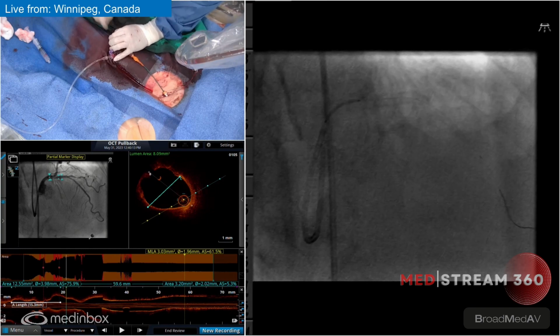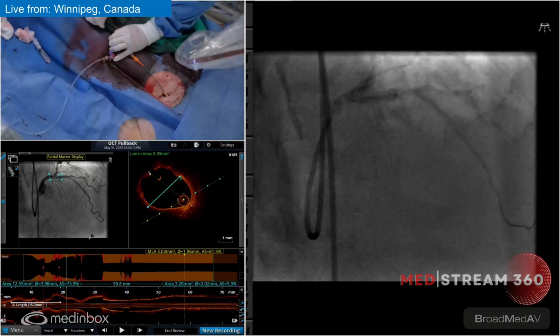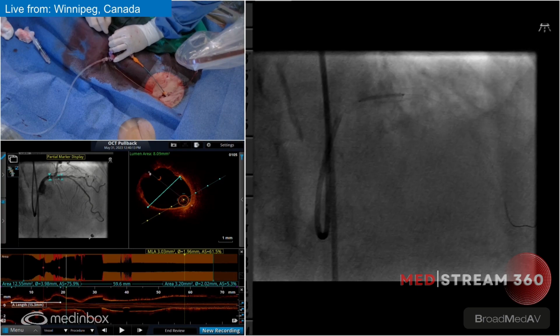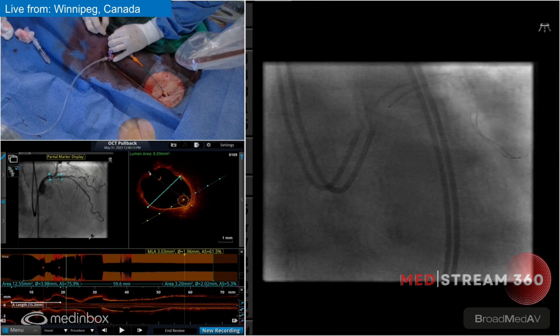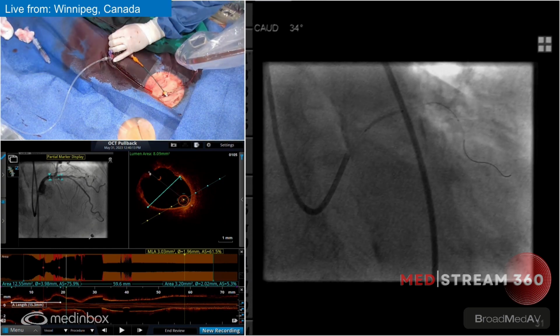Visual look at the, there we go. A little puff there, please. I want to make sure we're hitting it right at the spot. Yeah, your distal's good. A little puff again, please. Should we do caudal? Yeah, have a look at the proximal. Little test there. Brilliant. That's pretty good. I think it's a go.